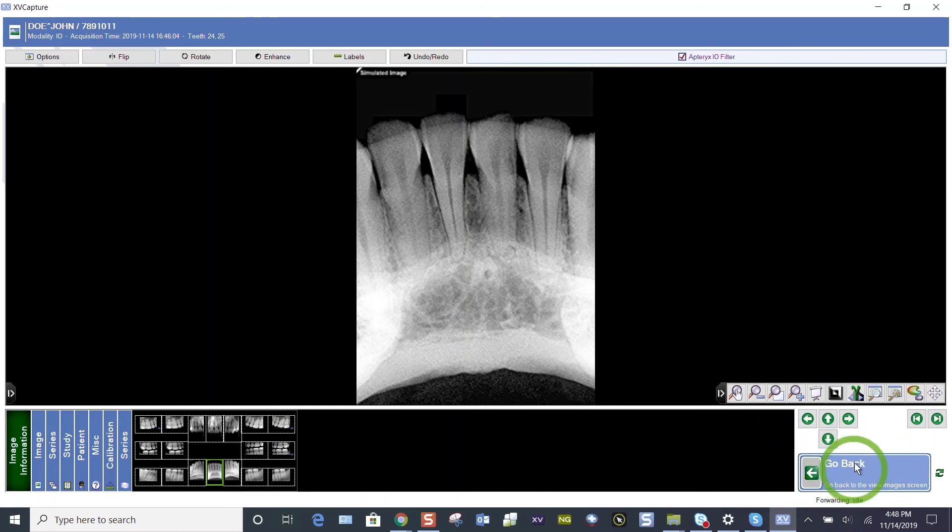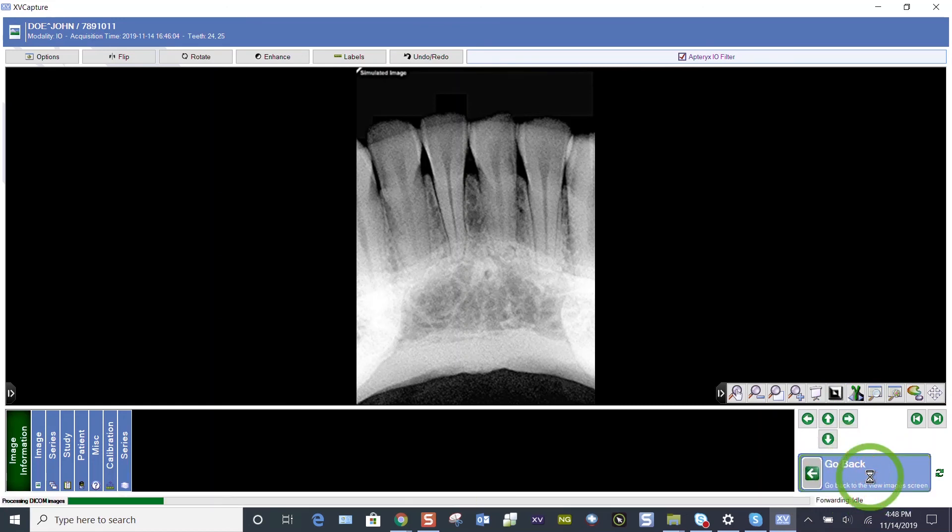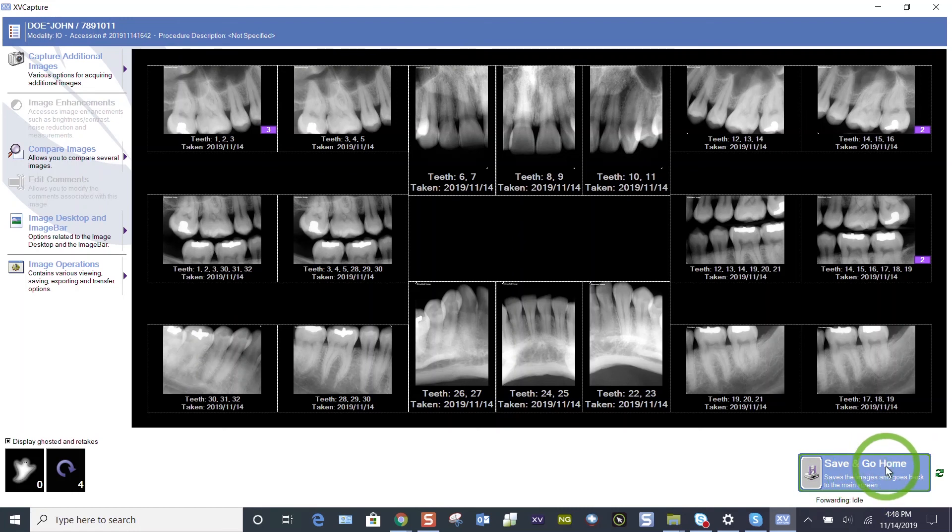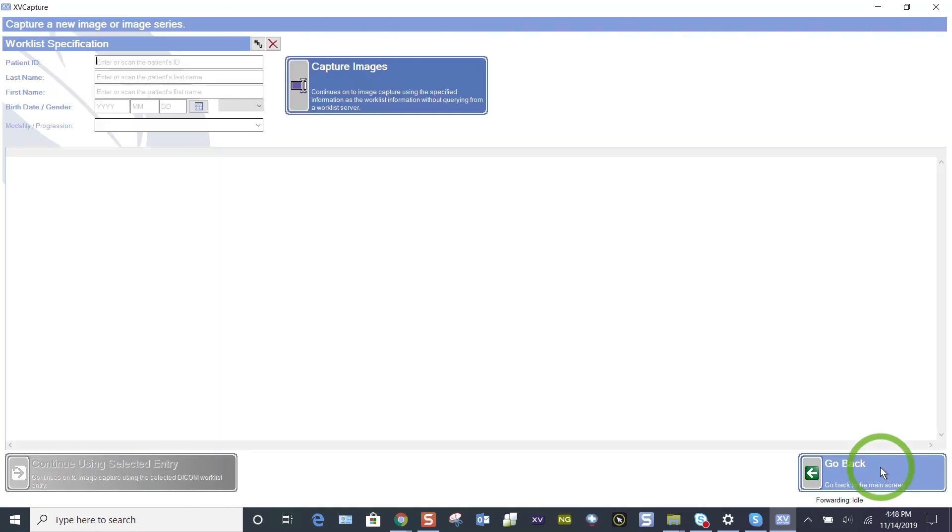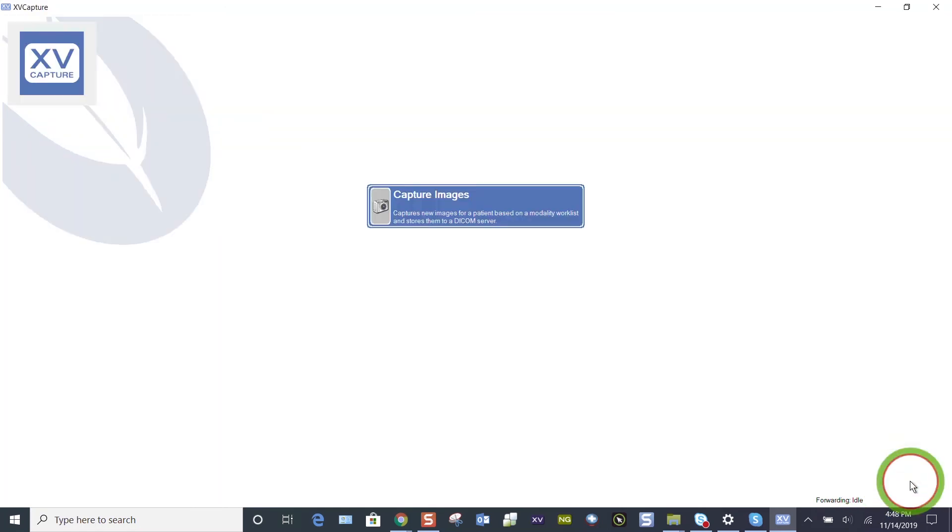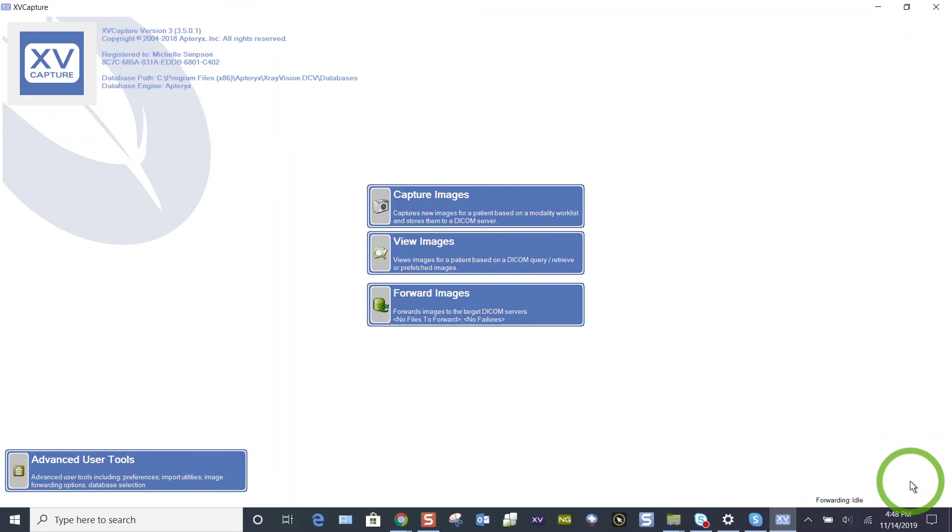The go back button is going to go back to the previous screen. When you're done with your patient, the save and go home, it's not really saving. They're already saved. It's just going home. And this little green arrow, you can save and go back, but you can flip that to save and go home. I want to show you how to quickly view those FMX 18s we just took.